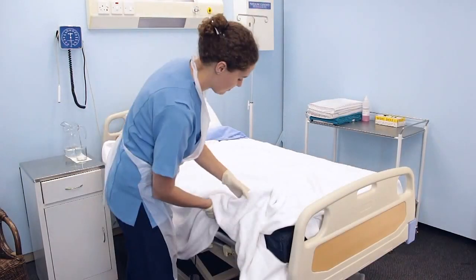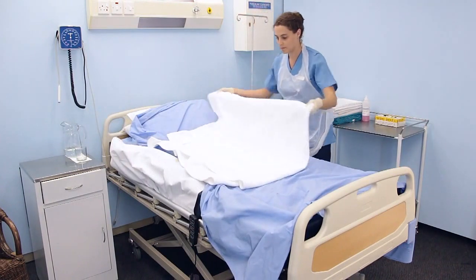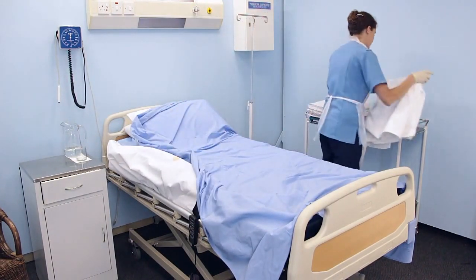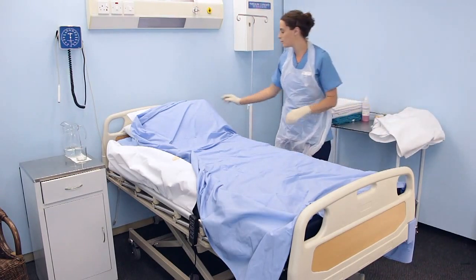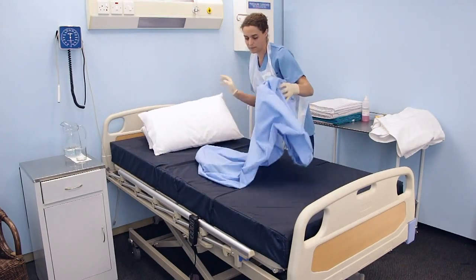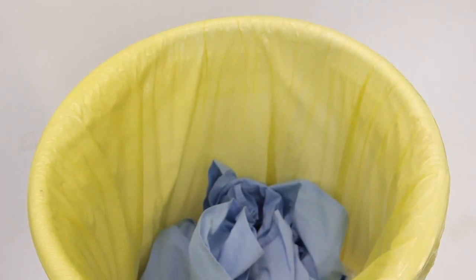Loosen all the linen as you move around the bed. Fold the linen that will be reused, such as blankets, bedspread or duvet, and place it over the back of a clean chair or on the clean surface used. Remove the linen items individually and place directly into the dirty linen bag or linen trolley. Please note, always keep used linen away from your uniform and never place used linen on the clean chair or surface or on the floor.